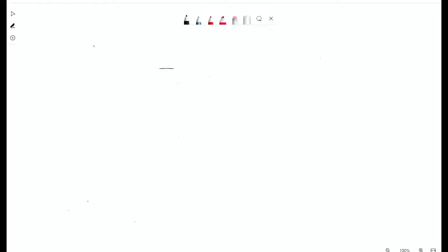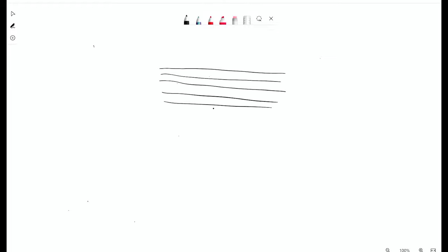Because 2D time of flight is just going to be one at a time, the individual slices are overlapped as well. But they're not doing a slab selective excitation or anything like that. It's just one slice, one slice, one slice, one slice. It's a single shot readout, I believe. I'm sure it could be more, but for the most part.